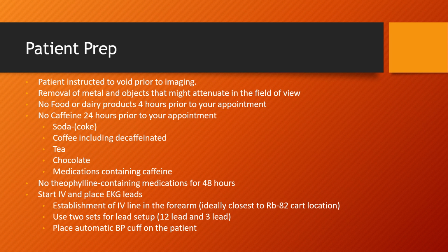It should be communicated to the patient that no caffeine includes sodas such as Coke, coffee, including decaffeinated coffee, teas, chocolates, and any medications that contain caffeine. The patient should be instructed to withhold any theophylline-containing medications for 48 hours.